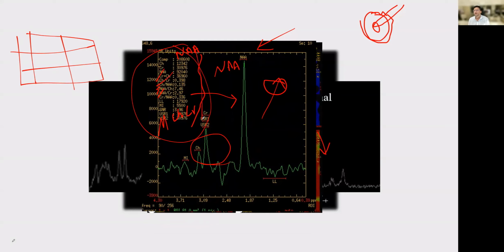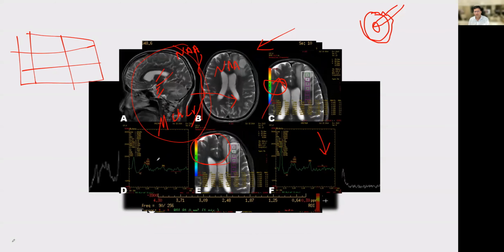Ultimately, you have to check everything you have done in the light of conventional imaging data. See, this tumor has extensive vasogenic edema, and there is another lesion here. You are comparing here with multiple voxels. The center of the tumor is one voxel. Voxel number 1 is showing some spectroscopy, and voxel number 2 is showing some spectroscopy. You will analyze the data in all the voxels, and only then will you come to conclusions.